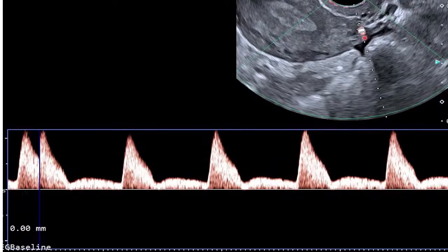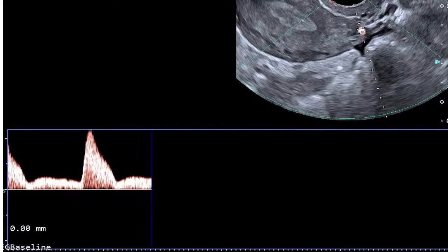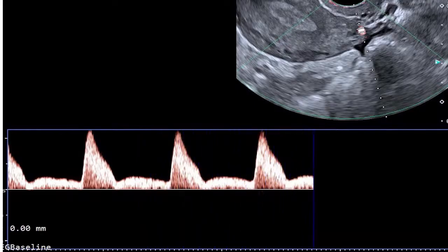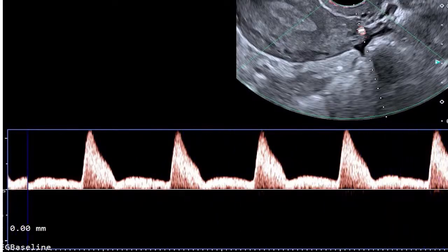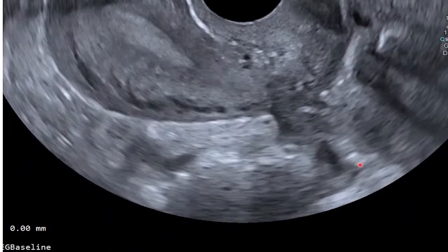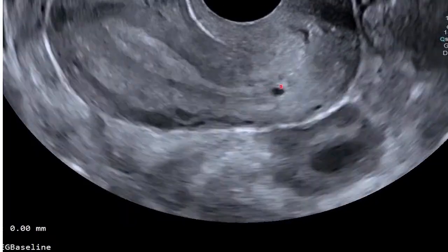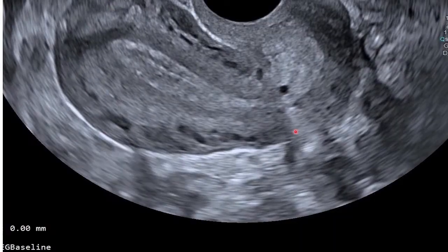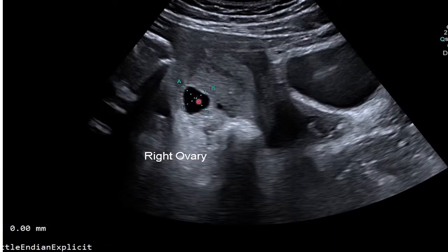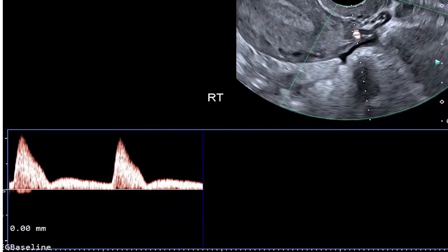So you must identify the uterine artery there, as you can see. If you are able to do this, it means you are in the right direction. This is one of the things that most people are not able to do, to identify the uterine artery. So this waveform is very critical. If you can do a transvaginal scan nicely, then you can demonstrate the uterus perfectly like that. Everything else will become very easy for you to then assess the uterine artery.